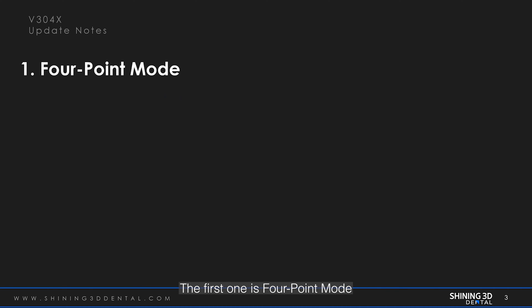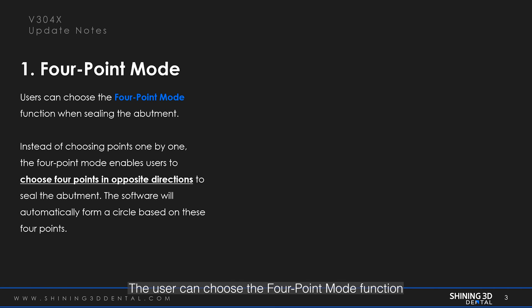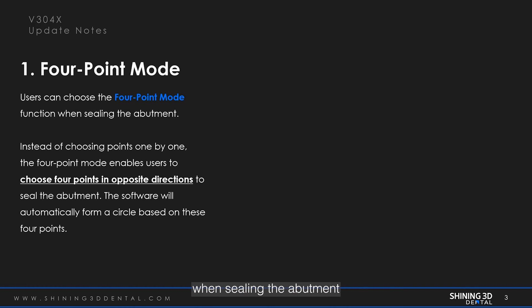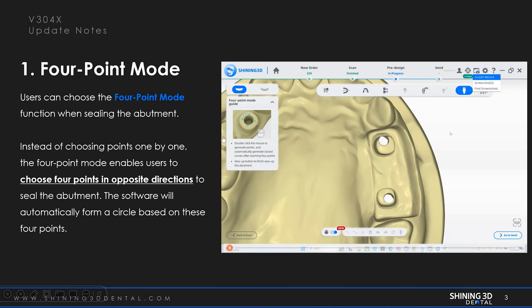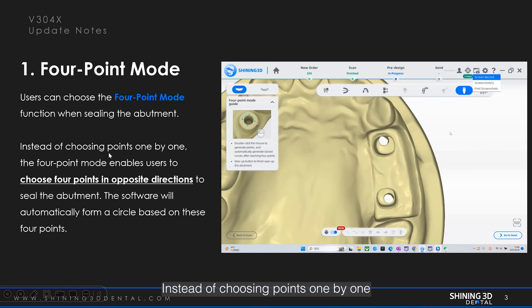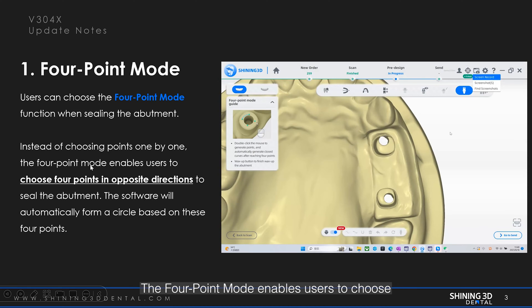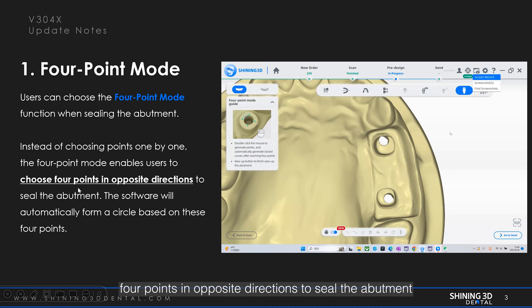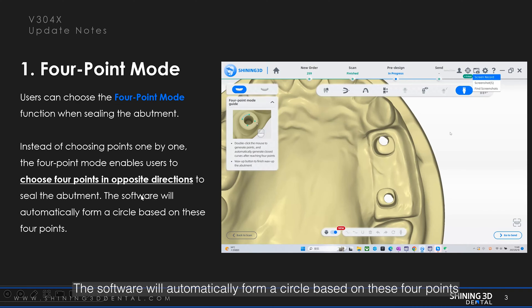The first update is four-point mode. The user can choose the four-point mode function when sealing the abutment. Instead of choosing points one by one, the four-point mode enables users to choose four points in opposite directions to seal the abutment. The software will automatically form a circle based on these four points.